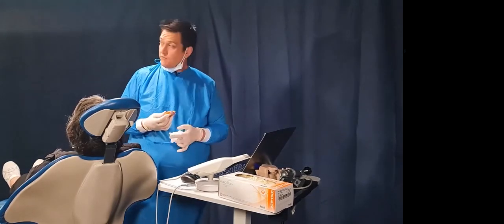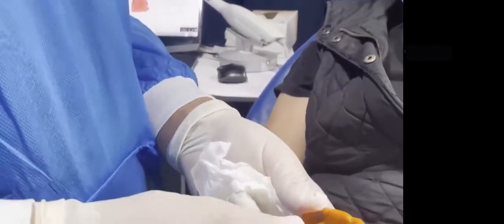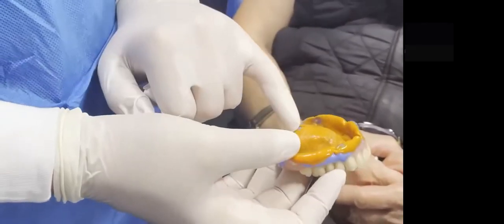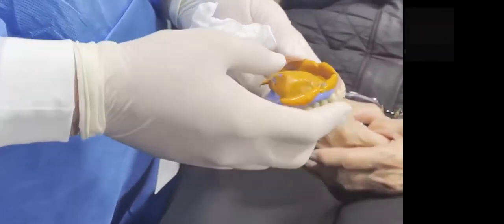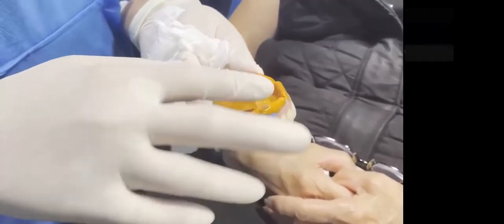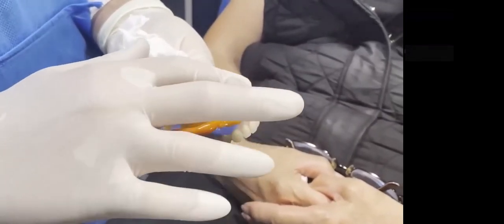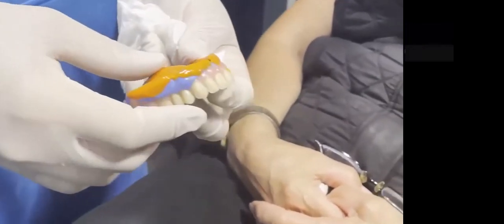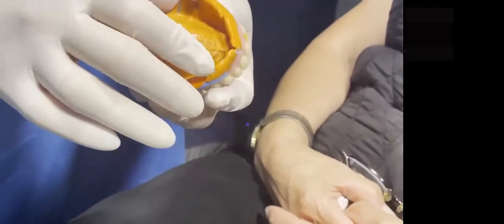And if we come over here, if our cameraman can come over here a little bit closer, you'll see here that our PVS, so you need to be able to do a PVS. I've actually got a little bit of a bubble there, which is not such a big deal. And again, be pedantic about your impression. It is important. But what I've done is I've got a really nice compressive sulcus aspect.